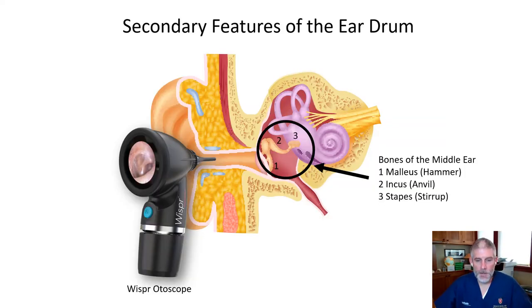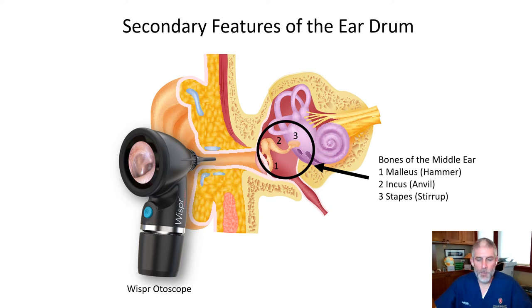Now that we've finished discussing the primary features, let's talk about the secondary features of the eardrum — things you can see in the middle ear because of the translucency of the eardrum. In particular, we'll be looking at the bones of the middle ear: the malleus, the incus, and the stapes, often referred to as the hammer, anvil, and stirrup. Of these bones, you can almost always see the malleus, you can often see the incus, and you rarely if ever see the stapes in a normal healthy ear.